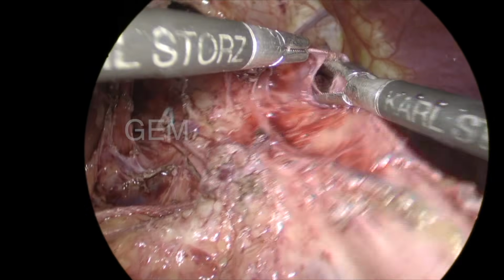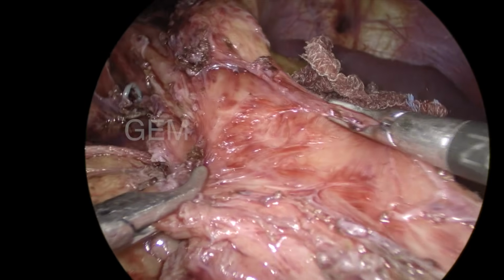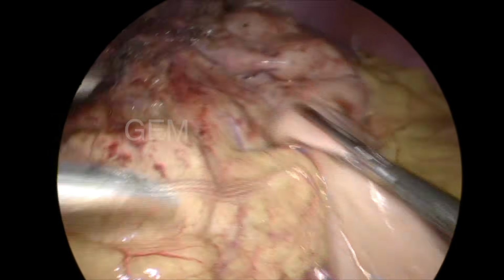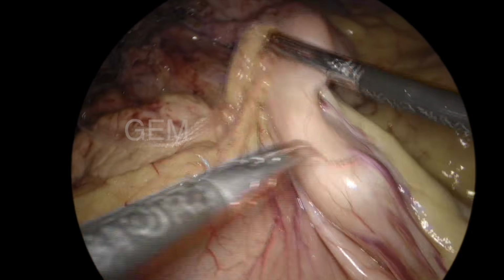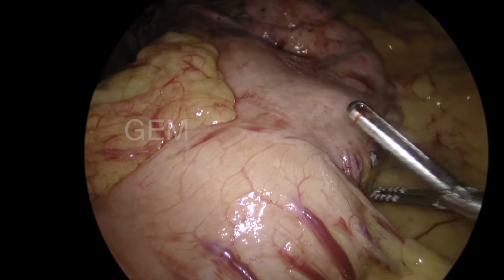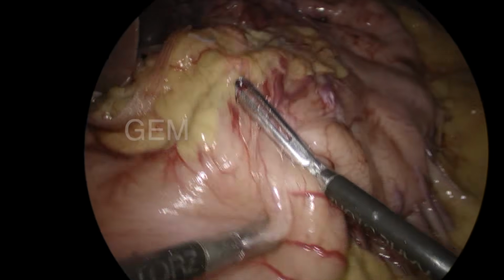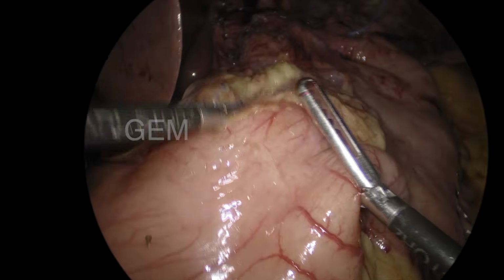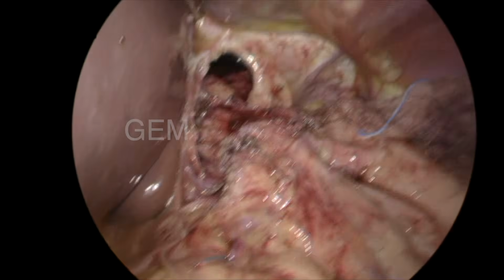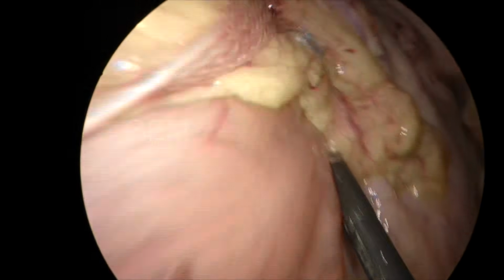The tip of the curve dissector should be blunt, and it should not be a long jaw. When you get the curve dissector from stores, ask for the regular one, because a long jaw curve dissector is also there. We want a regular one, not a long jaw. Long jaw will have a sharp tip. So I occlude the body of the stomach, and then I ask for a perioperative endoscopy. One of my medical gastro colleagues is doing the endoscopy now.